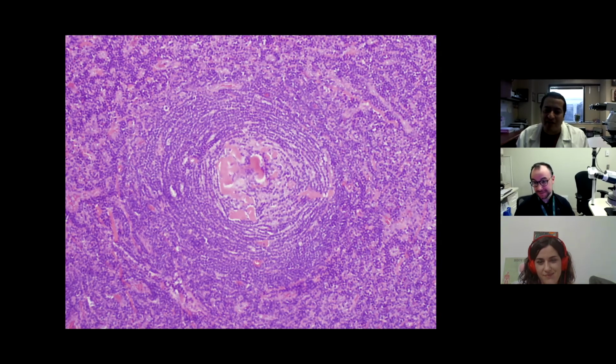Maybe they ask unfair questions on the boards. No, I think this could definitely be a board exam question. Yes, they do ask unfair questions like this on the boards. And really, in real life, you won't be diagnosing this without sending it to a hematopathologist. But Castleman's is the right answer, and you get this onion skin appearance and this sort of lollipop, the little thing coming off to the side. This is not the greatest lollipop because it doesn't have a good stem, but that's what they mean by the lollipop sign. It's just a funny looking reactive node that might show up on your exams, characteristically producing a mediastinal mass. Okay, Castleman's disease.